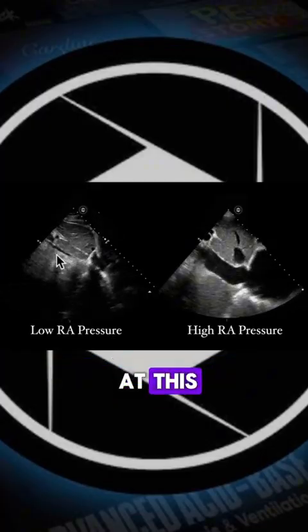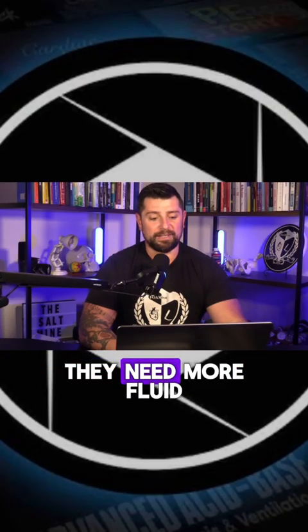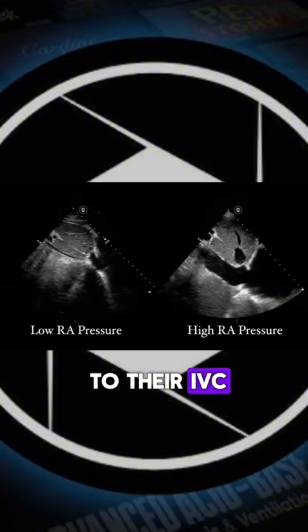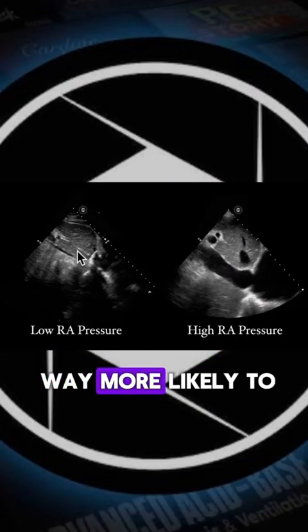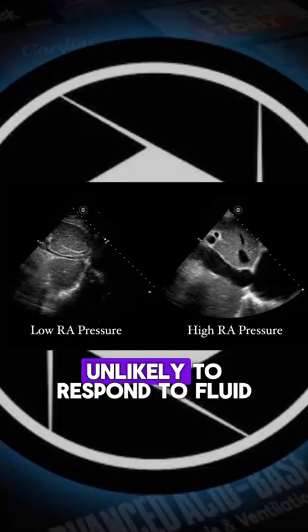Some people will look at this and the patient will have gotten 4 or 5 liters of fluid, and they're like, oh, they need more fluid, and they're trying to fill this person all the way up to their IVC, when in reality, they need to add some Levophed. They need to add some more vascular tone. However, this patient is way more likely to respond to fluid, where this one is unlikely to respond to fluid. So it's kind of a secondary confirmation point after you look at the heart.